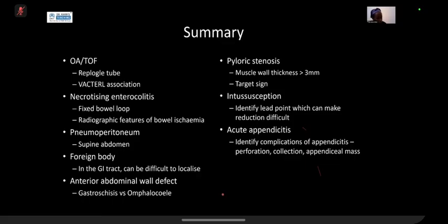The anorectal malformation should be diagnosed clinically. We've talked about necrotizing enterocolitis, so we're looking for non-specific signs on radiographs, which include dilated thick-walled bowel loops, or non-changing bowel gas patterns, or distended bowel loops, as well as more specific signs, which are pneumatosis intestinalis, portal venous gas on the plain film, and pneumoperitoneum. And also the importance of the use of ultrasound in necrotizing enterocolitis, primarily for follow-up rather than diagnostic imaging, and it having similar features as we see on the radiograph.